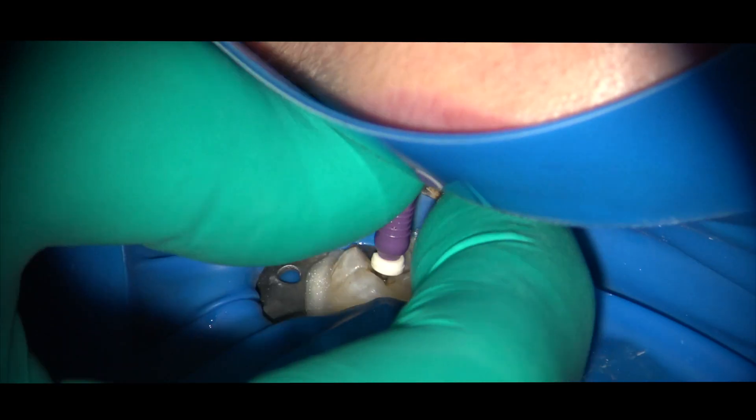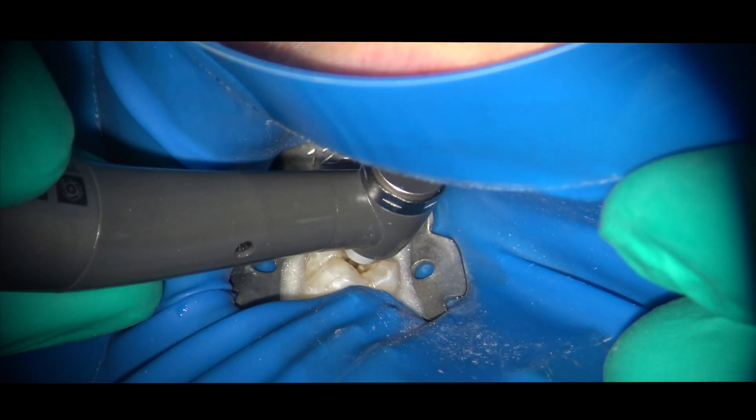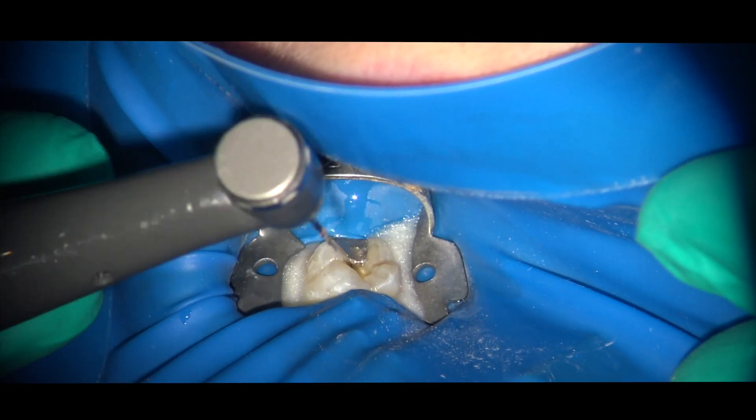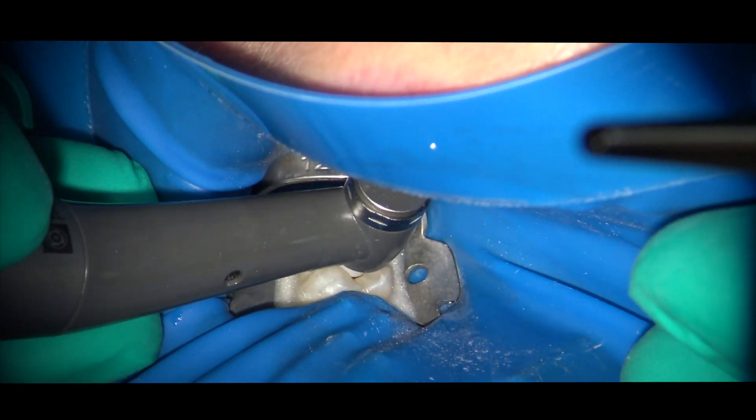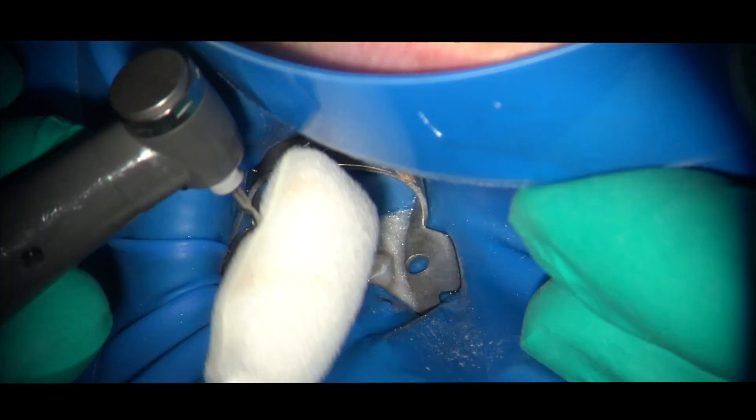You just have to make sure that your crown-down strokes are minimized to one to three strokes and that they are passive — meaning you're not pushing the orifice opener or the mid-root shaping file beyond their passive cutting points — and make a conscious effort to stay short of the available length. The goal is to use hand files to scout the canal to available length, then use NiTi files to remove the coronal restrictions, then advance the hand file again to its new available length.